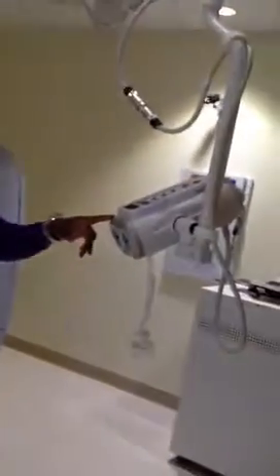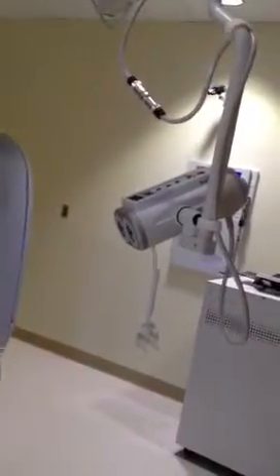We'll start the IV and we'll start the injection. This is the power injection we use for the IV contrast. And after that, you have yourself a set of beautiful CT images. And they are done not superimposed, but in a slice section. They take each section of the area of interest. And then the doctor has a good set of films that he can read and give you a diagnosis.